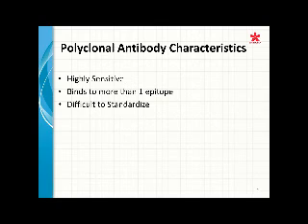Your IgG antibody would act as an antigen and stimulate the rabbit to make anti-human IgG antibody. So your IgG antibody that's extracted from your blood and put into a rabbit is going to have the rabbit create its own immune response and create anti-human IgG antibodies to your IgG antibody, because your IgG antibody is acting as the antigen. The serum from the rabbit would then be used as a polyclonal anti-human IgG antibody reagent.